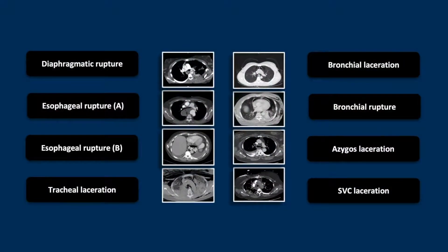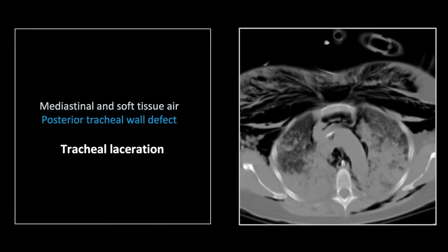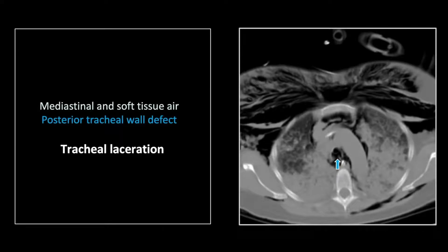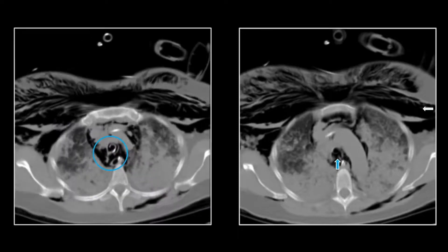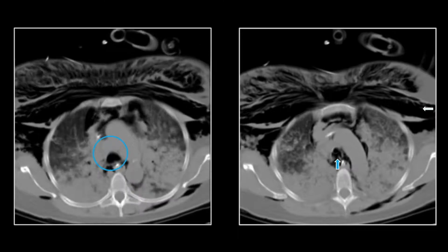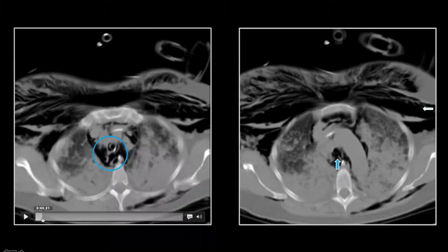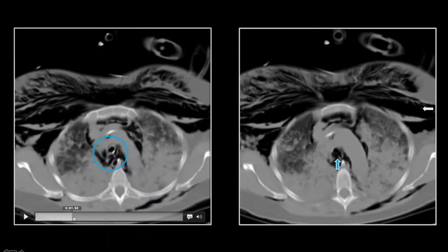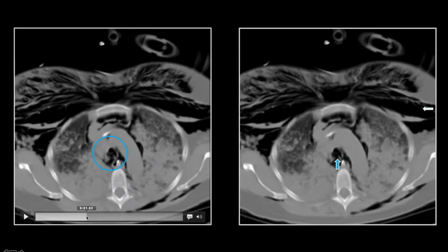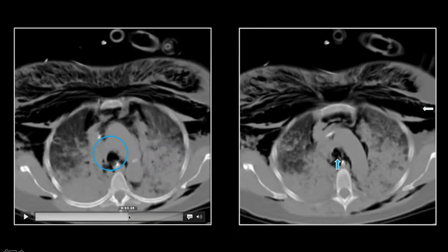Our next case is a traumatic tracheal laceration. There is extensive extrathoracic soft tissue gas. You can see a small defect in the posterior and distal trachea immediately adjacent to the tip of an endotracheal tube. This relationship is better demonstrated on the movie, where you can really appreciate the defect in the posterior wall of the trachea immediately adjacent to the tip of that tube.